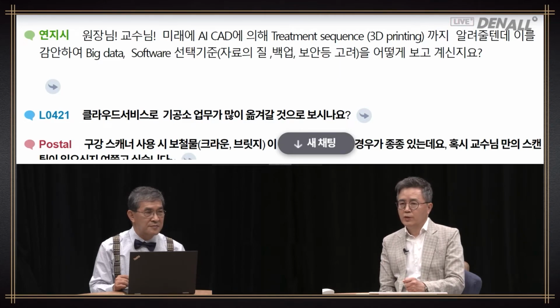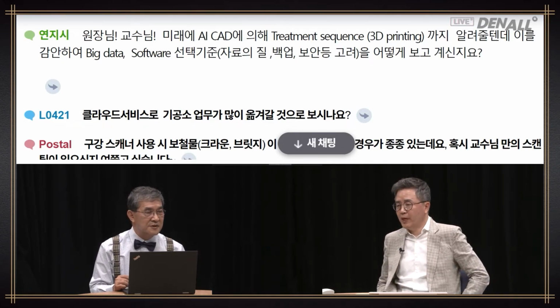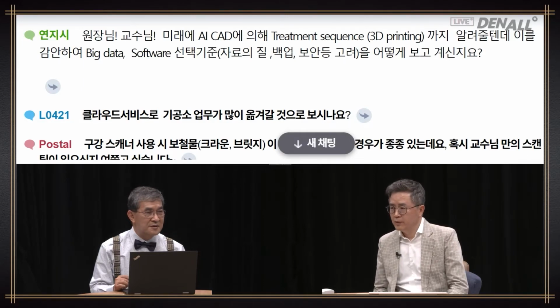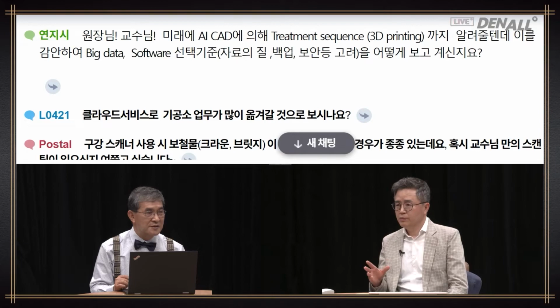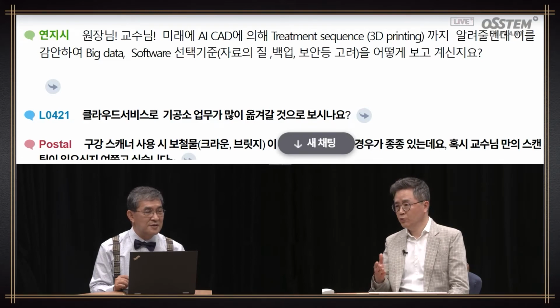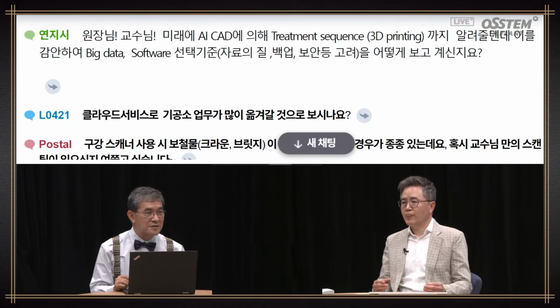In the case of denture alignment, I've talked about pants or clothes and classification of small, medium, and large. If the average occlusion of Koreans can be classified as class 1, as in the sense of the clothes, is there a template where there are different segments between class 1, 2, and 3? I don't believe so. There are too many to do three-dimensionally.